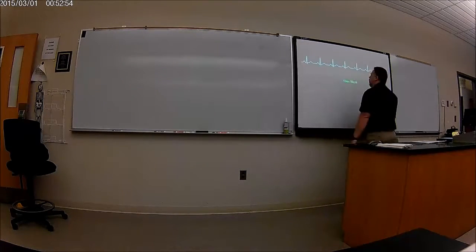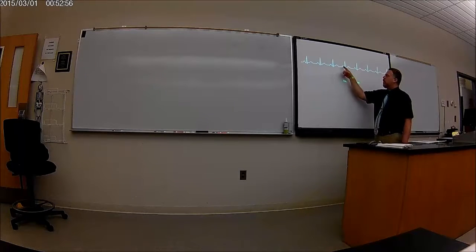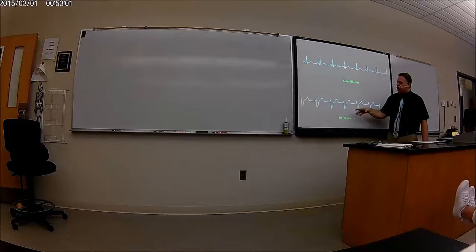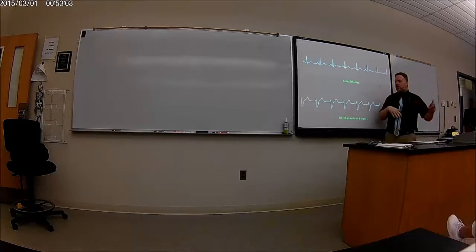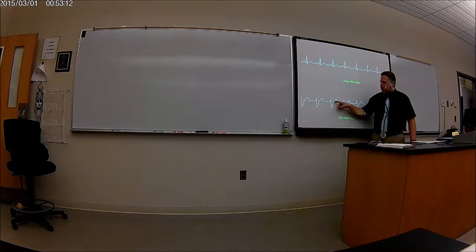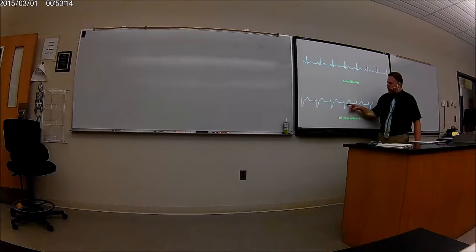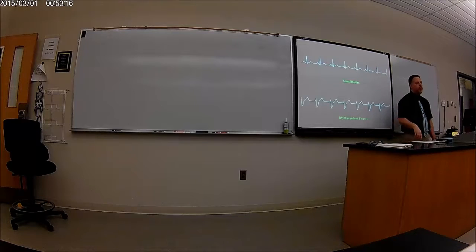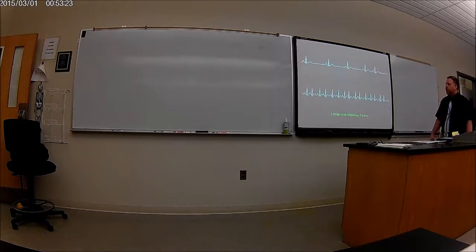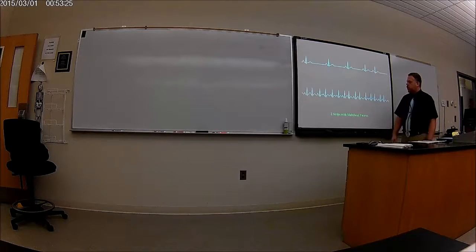So sinus rhythm over here. All right, meaning there's P, QRS. And here, I know they look weird. You'll learn about these in another class, but there's no P wave. So there's no P. You got a QRS, and here's the T. QRS, the T. QRS, the T. There's no P wave. So I know that there's no pacemaker working over there. Does that make sense? All right.